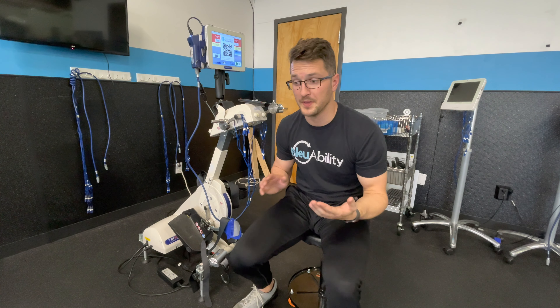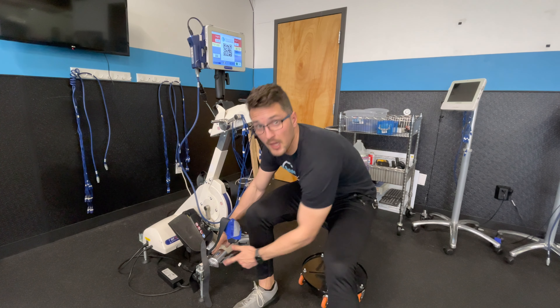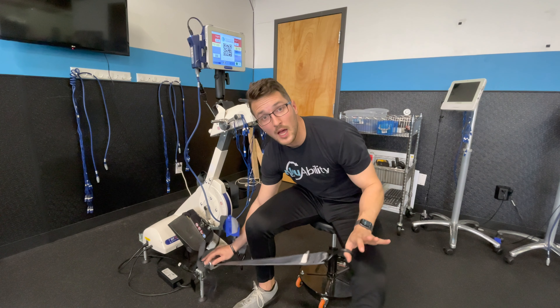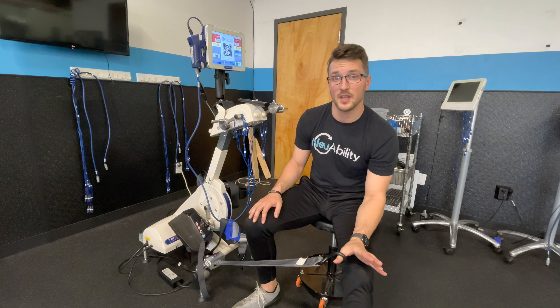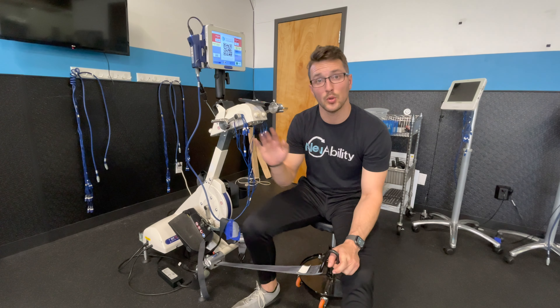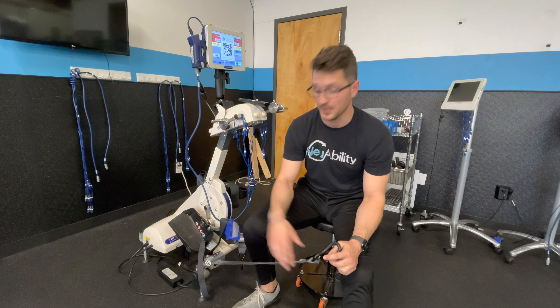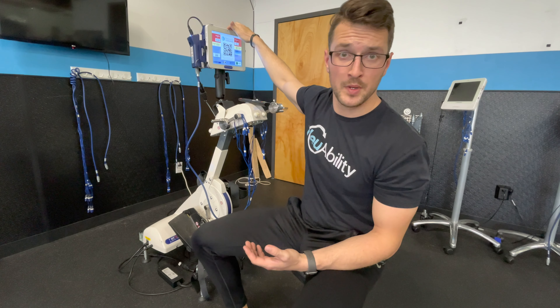Since the client is pushing into resistance, the physics have to be in check. We have seatbelt straps that hook and lock onto the individual's wheelchair to hold them in position. This is necessary when pushing a lot of watts or high resistance, because we need an equal and opposite force counteracting the force they're pushing into.